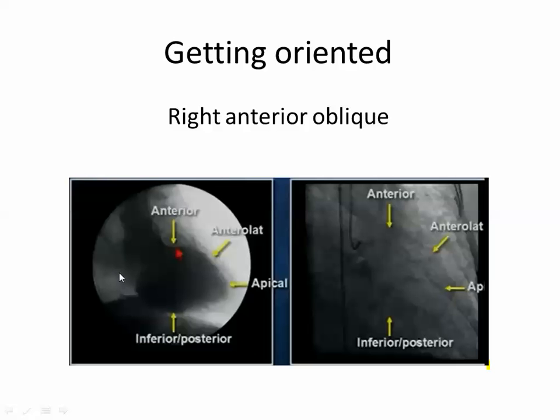If there is mitral regurgitation, the contrast will go there. If we remove the contrast, and we don't routinely do LV angiogram, just imagine the catheter is here and it is RAO view. So what is this wall? It's anterior. Here anterolateral, here apex. So what is the vessel coming here? It's the LAD. Is it clear?